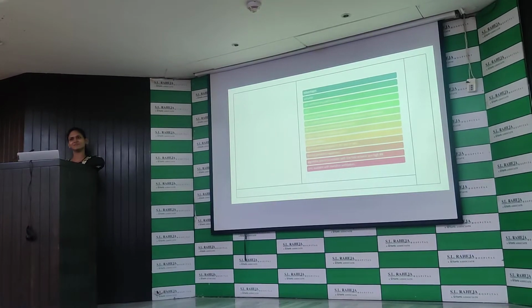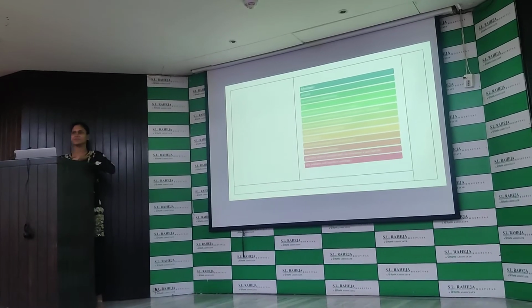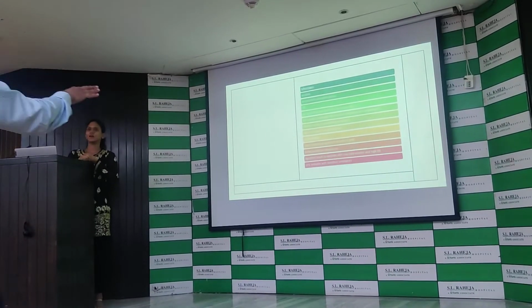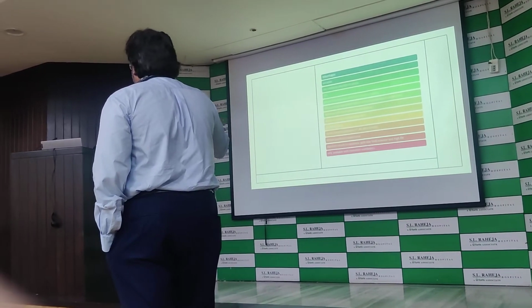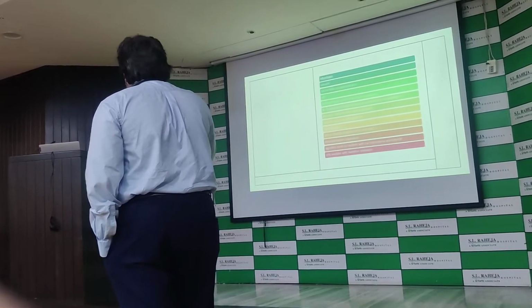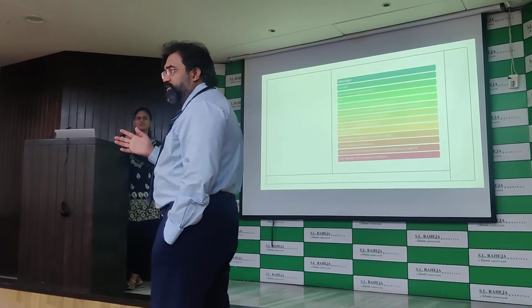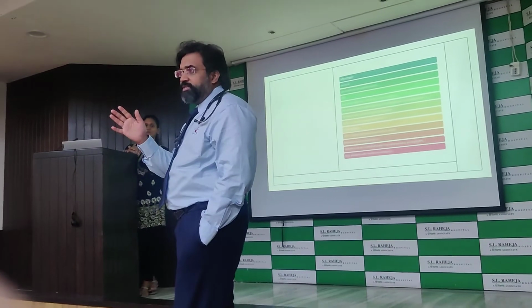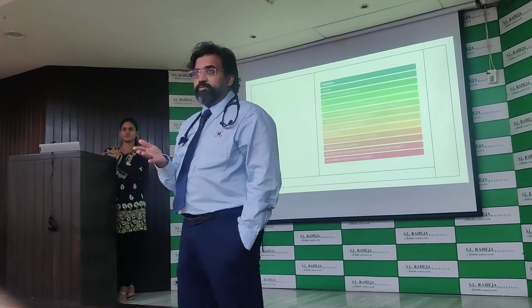So that's what happened in one of our patients. What happened to that patient that we were on? He started breathing at a higher RR. Yes, the patient is ventilating at a higher RR. But you must understand that a higher RR is not as difficult as a higher tidal volume. The pathology is different. The patient is breathing fast, the ventilator is breathing with the patient fast, but it's not giving high tidal volumes.